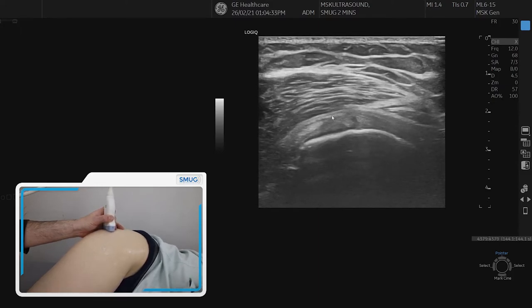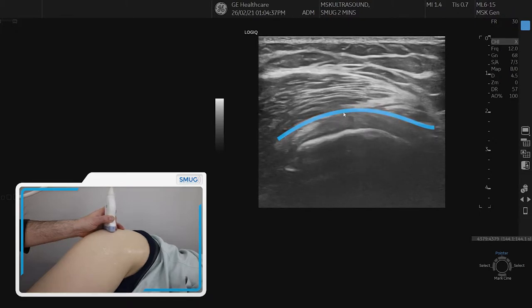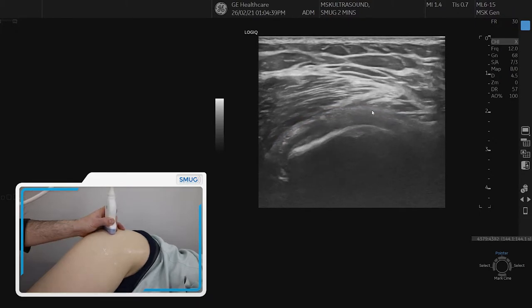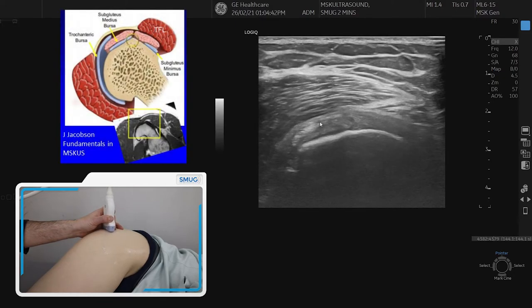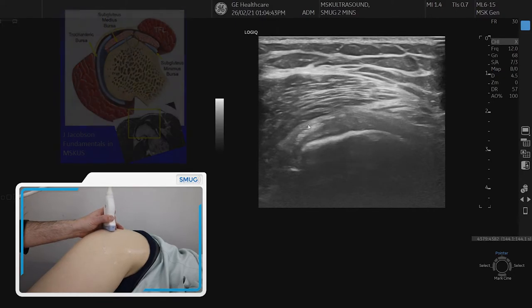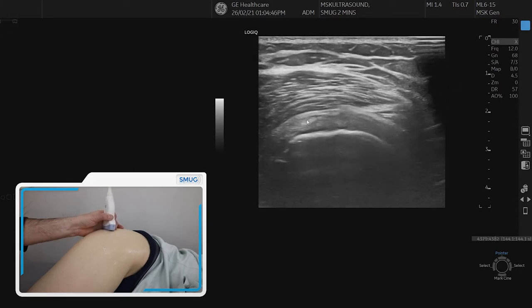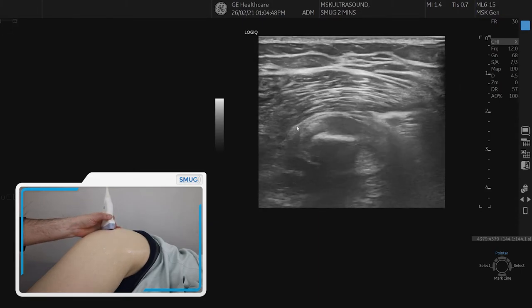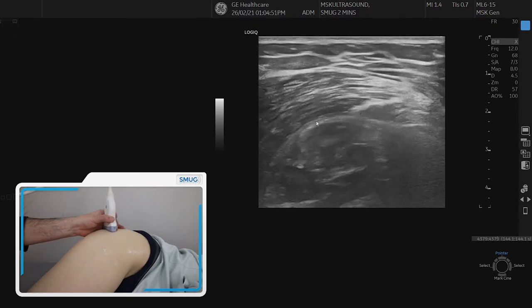Now between the deep layer and the superficial layer there is a bursal plane, and like in the rotator cuff in the shoulder, there could potentially be bursitis or swelling occurring in that bursal plane. And that's what you have to bear in mind — it goes fairly far posteriorly. So don't underestimate how far posterior it goes.